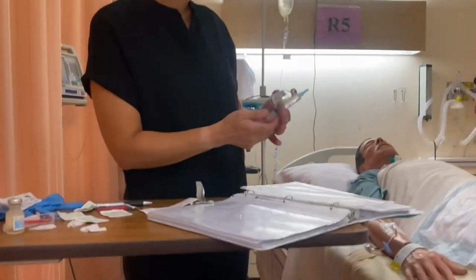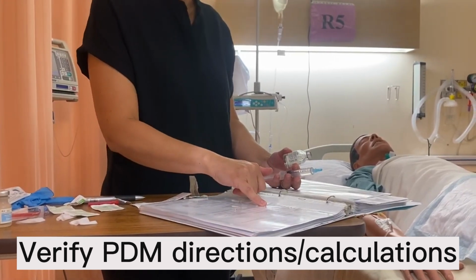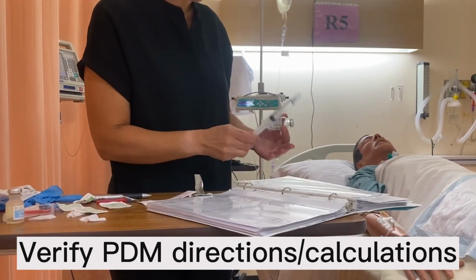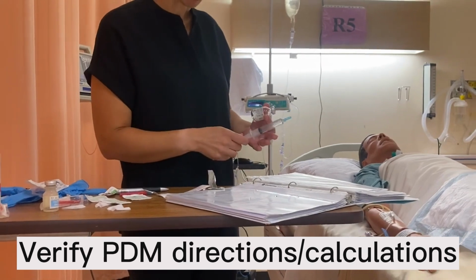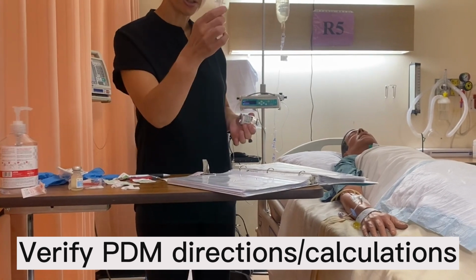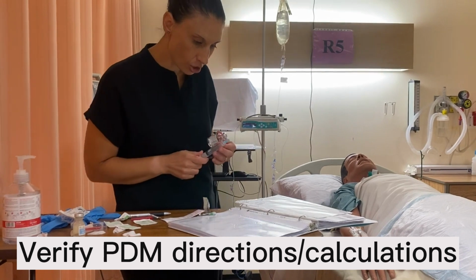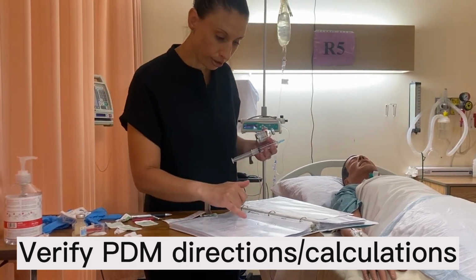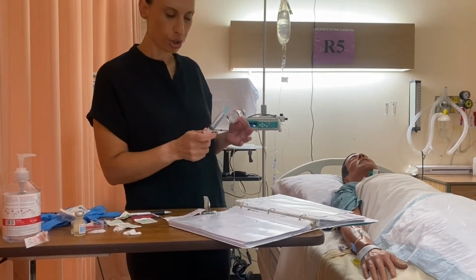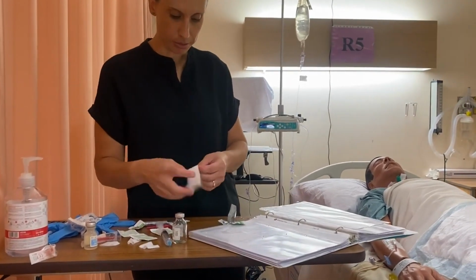I'm also gonna take a look at my syringe and my PDM and make sure that I have reconstituted this correctly. It was a 500 milligram vial, so I needed 10 mLs of sterile water, and so that gave me 50 milligrams per ml, and I needed the whole dosage for my 500 milligrams, so that's what I have in my syringe. I have 10 mLs in here, and that's all I need to do. I do not need to dilute it any farther because I can give it undiluted over 3 to 5 minutes. That's under the IV push criteria there. Okay, so I'm gonna affix my label.